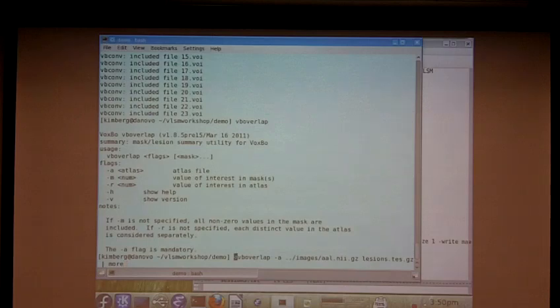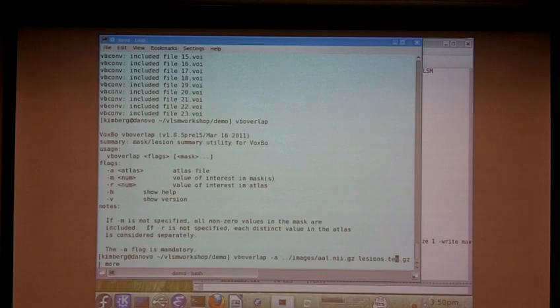I'm running VBOverlap. I'm using the AL atlas as the atlas, our lesion file as our set of lesion maps, and I'm sending it through more because it's going to generate a lot of output.